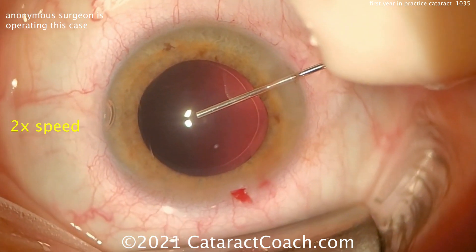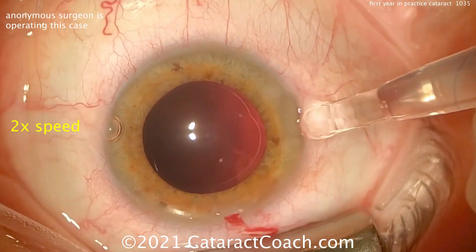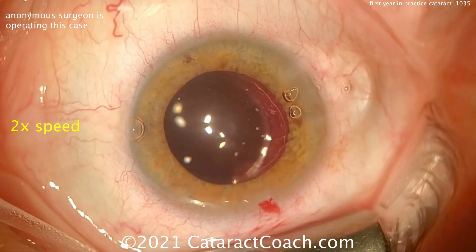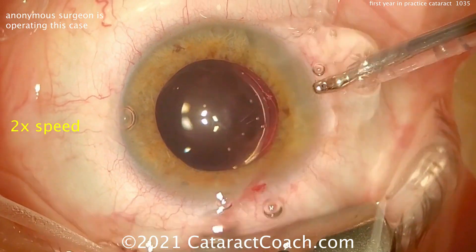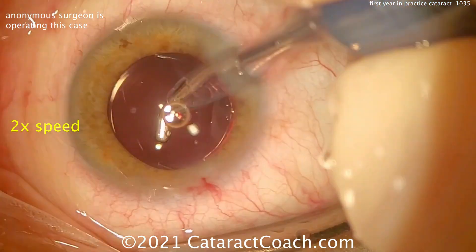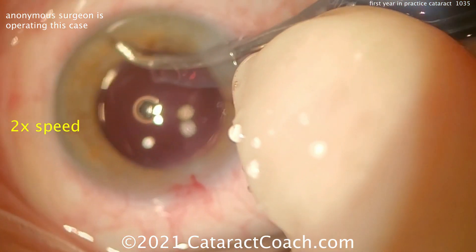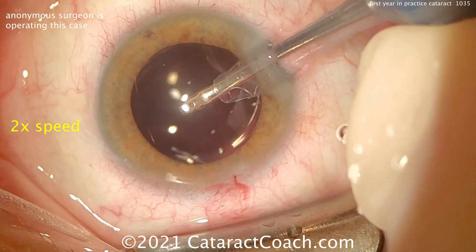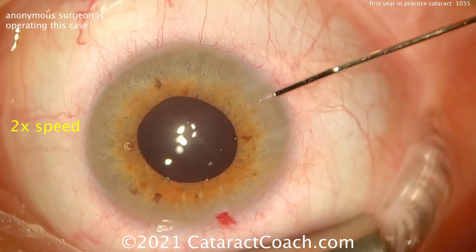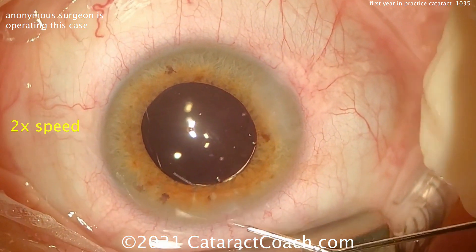Here comes more viscoelastic — probably cohesive — filling up the bag. The rhexis looks pretty nice. The lens is going inside the eye — looks like a three-piece silicone lens. Goes right in the bag with just the injector — that went beautifully. Remember, silicone lenses unfold a lot faster and easier than the acrylic lenses. Cleaning out the viscoelastic — good thorough technique. Hydrating the incision — incision looks pretty good. Very nice technique, I like the surgery.